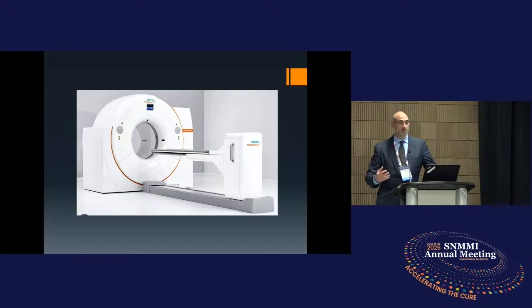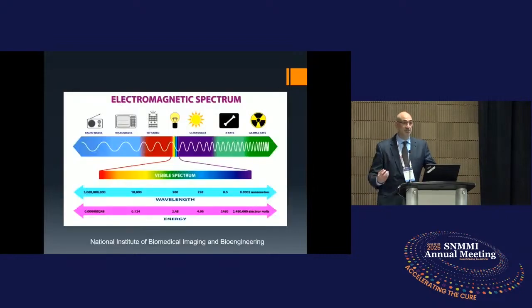You're going to sit in a room for a little bit while the radiotracer distributes in your body, and then you're going to be brought into one of these rooms, which tend to be very serene. We try to make it more water lily-ish. You're going to sit there, and the machine isn't loud like an MRI machine, and we're going to take pictures for probably around 10 to 20 minutes. Your entire time in that room might be 30 minutes, and that's what it should be like. But there's a lot more going on for us to be able to take those pictures.